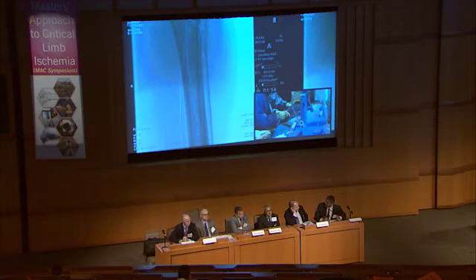And what specific coils? Because you did mention that these AV fistulas are quite notorious in terms of changing their size, so embolization of these coils is a tangible and practical problem. So are there any tips or tricks? Anyone in the audience or in the panel, please?